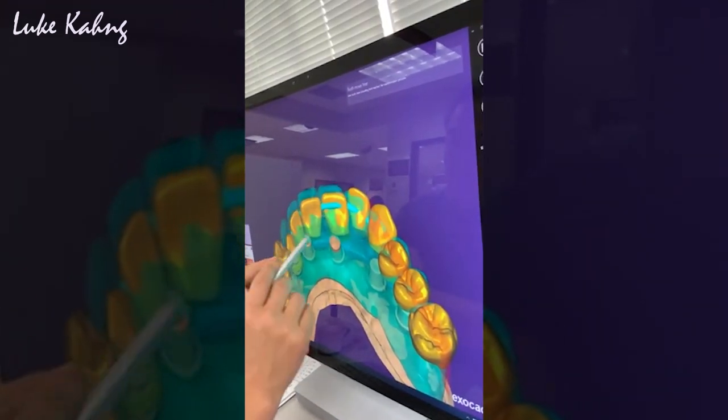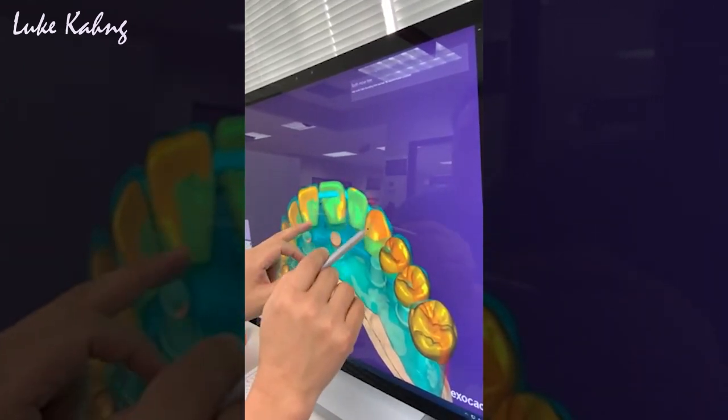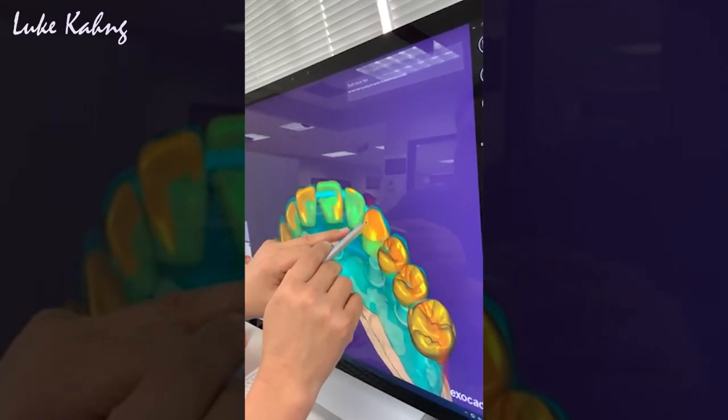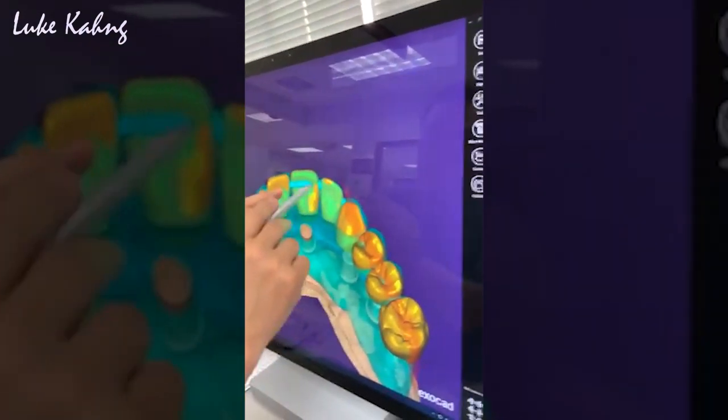Okay, so I'll engage it. But I'm trying to make this a better contour. So if you see too much sticking out, I'll cut it here, take it out, and then we can solve this issue.